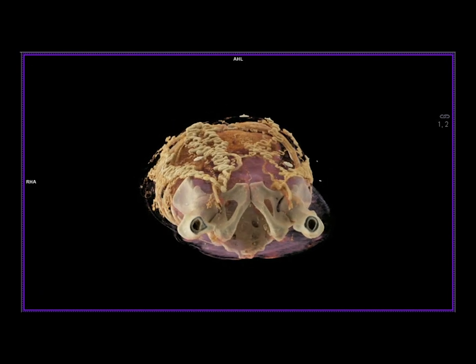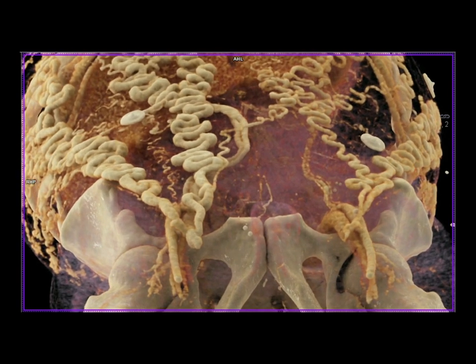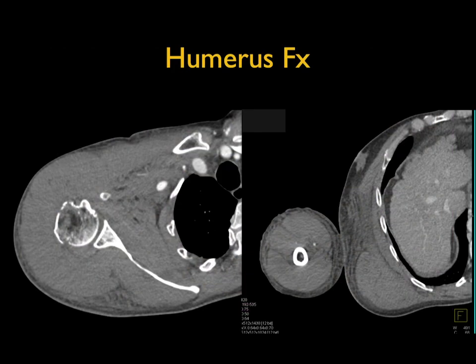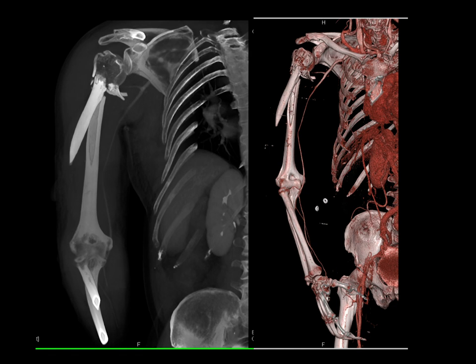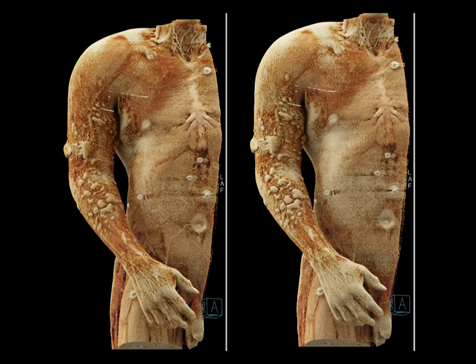A very good demonstration of how you can show specifically what you need to see by simply changing the parameters. Here's a great case of a patient who had a fracture but the arm was swelling and they couldn't figure out why — maybe a hematoma. You see the humeral head fracture but not much else, a little bit of induration. On the recons with MIP and volume rendering, you see the axillary artery, brachial artery, and radial ulnar arteries are all patent — no pseudoaneurysm, no vessel occlusion, just a spiral fracture with angulation. But what no one appreciated was the patient's skin: there are multiple blisters now present and the patient has a compartment syndrome. The patient was wrapped up and no one saw this, but look how obvious it is on the CT. When you go back to the axials, it wasn't obvious at all. The cinematic shows this, which is why we think about doing some sort of virtual topogram.